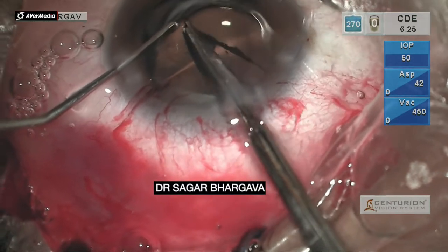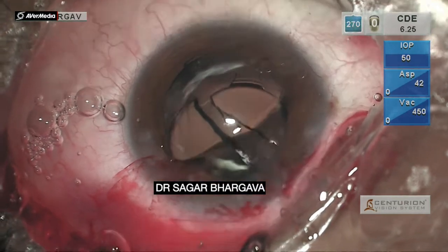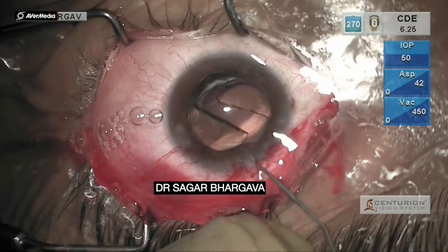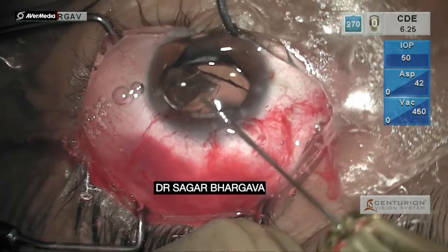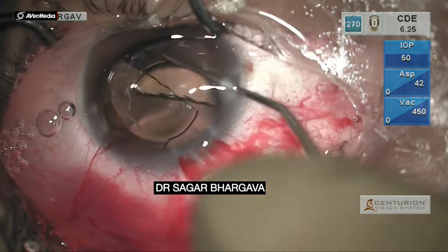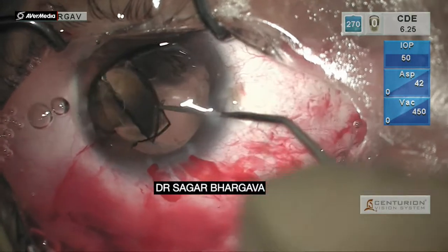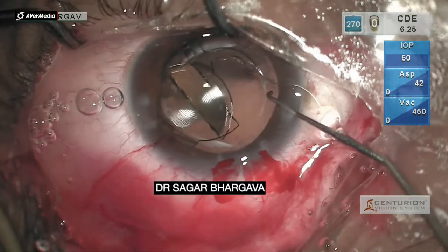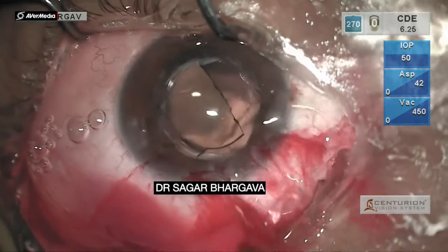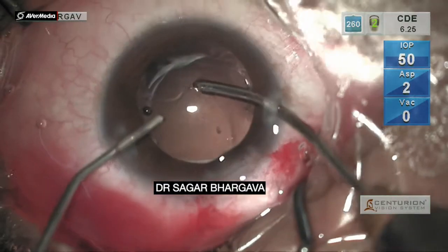All these maneuvers are done under a significant amount of viscoelastic cover — specifically dispersive viscoelastic chondroitin sulfate. As we can see, there are two pieces of the IOL. The lens is being oriented towards the corneal wound and then with the help of forceps, the lens pieces are picked up.